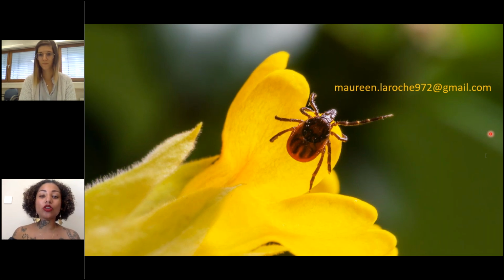And I know that there are some teams that are now switching to the cephalothorax of mosquitoes for different reasons, because this is mostly where the pathogenic agents are found, but also because legs are so fragile that sometimes if your sample isn't stored properly, all the legs will have fallen off and you won't have much for MALDI-TOF. Although the cephalothorax is, of course, often still there. So it works quite well. I know that some other teams also use the head, the capitulum of the tick, which seems to be working as well, but this is not something I've done yet.